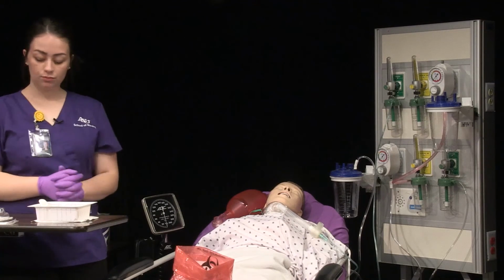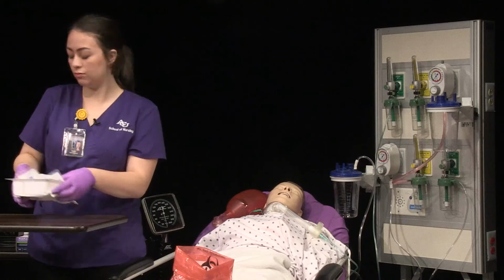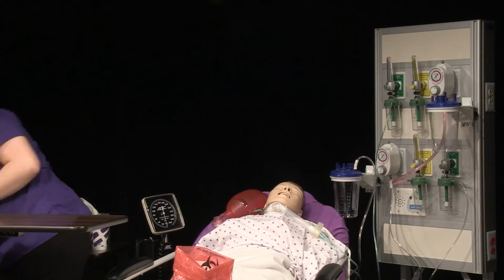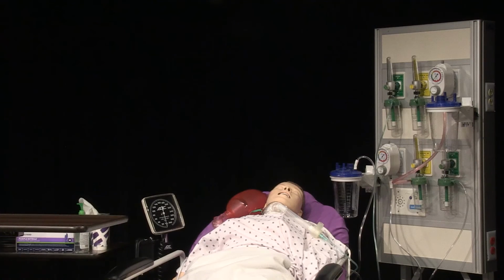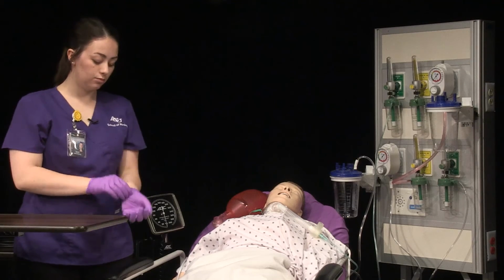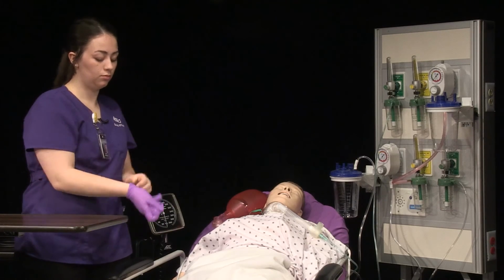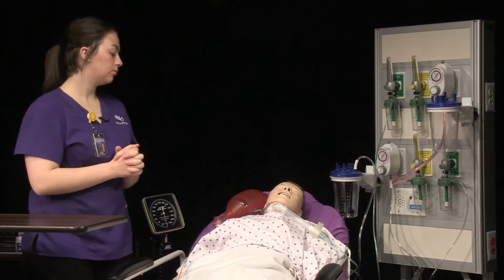Dispose of supplies. And properly dispose of PPE. Perform hand hygiene.